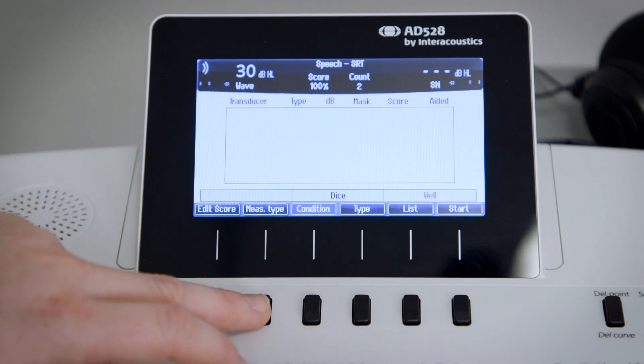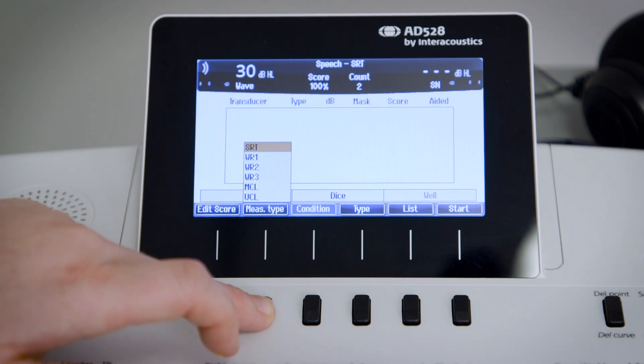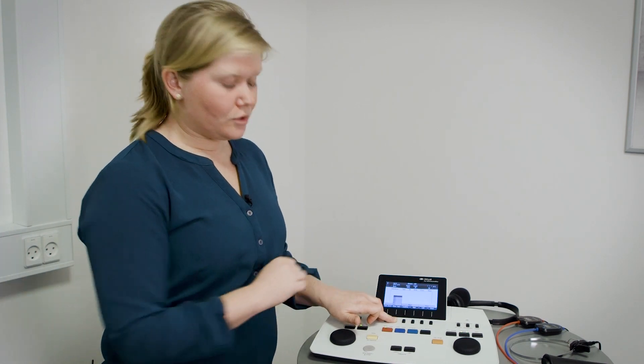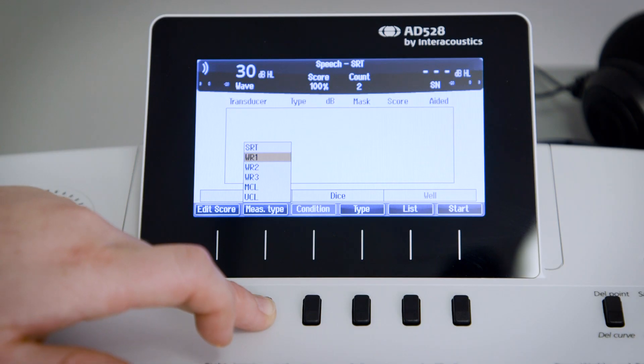In addition to that, you can change your measurement type. Right now it's set for the SRT, the speech recognition threshold, that can be changed to the word recognition where we have a word recognition one, two, and three.